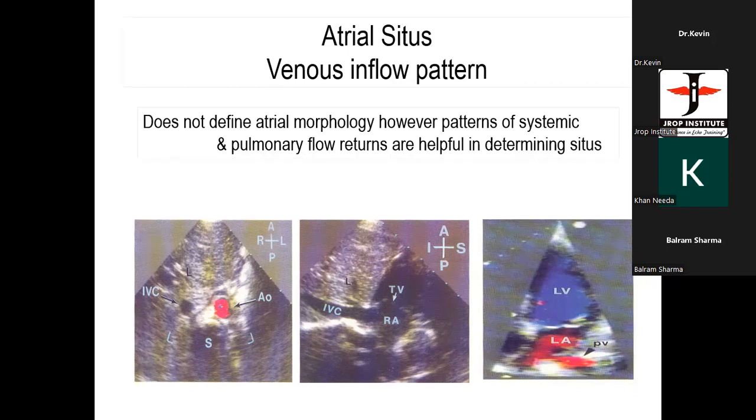If we transform this 100 into velocity, using 4 into velocity squared, we divide by 4, that gets to 25. The square root of 25 is 5. So the velocity across LV and RV is 5 meters per second, and hence our TR gradient is almost negligible.